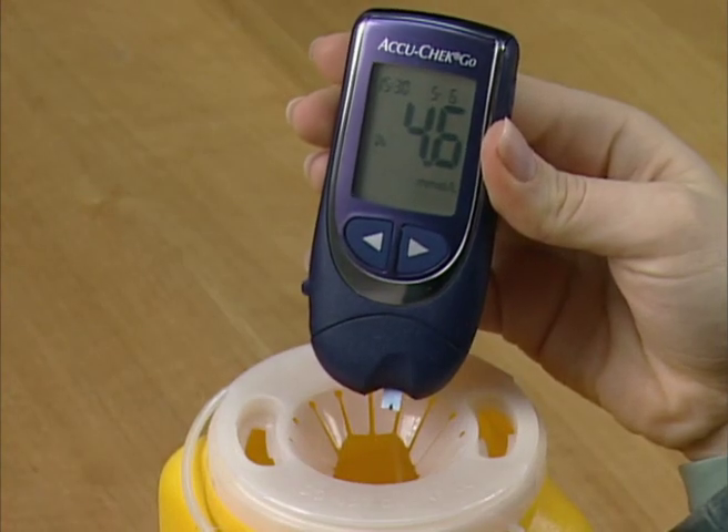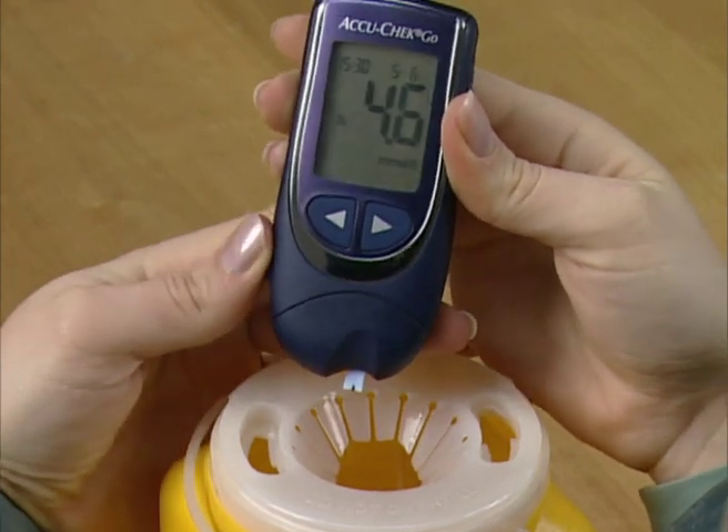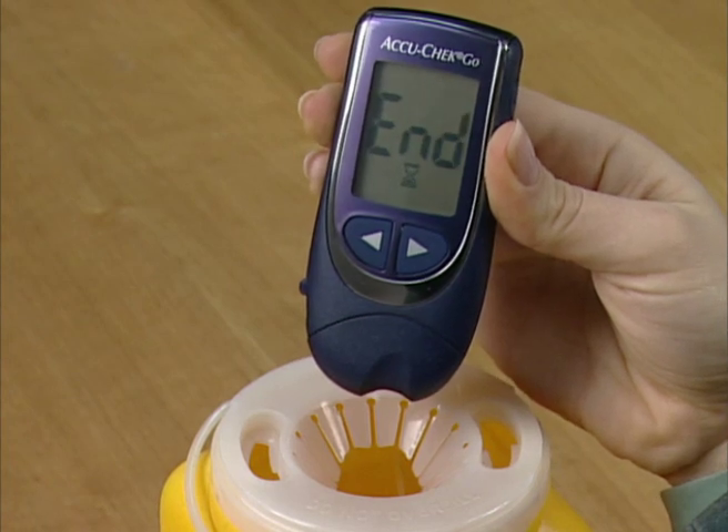To eject the used strip, hold the meter directly above a waste bin. Then press the strip ejector forward until the strip falls out. The meter will turn off automatically.